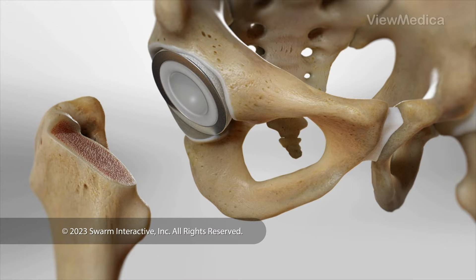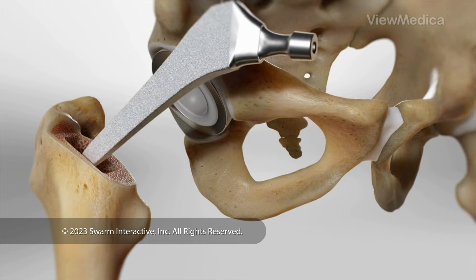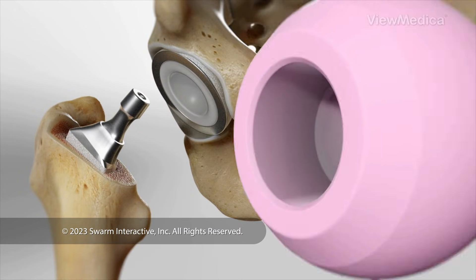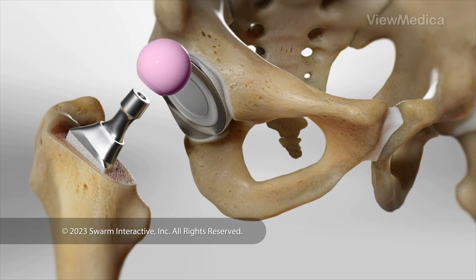Now, we focus on the femur implant. We hollow out the end of your femur. Then we place a long narrow implant, called a stem, into this bone. We fit a ball on top of the stem.